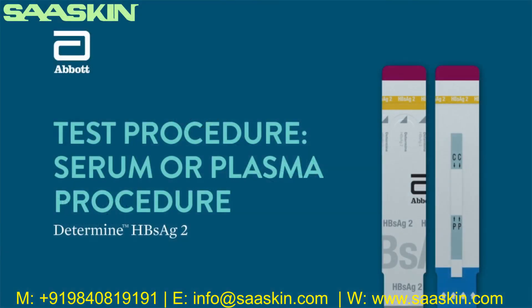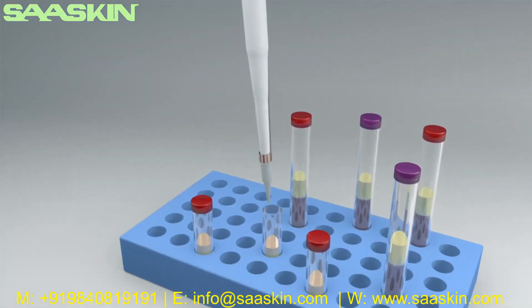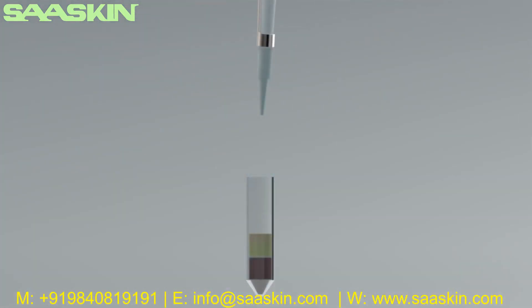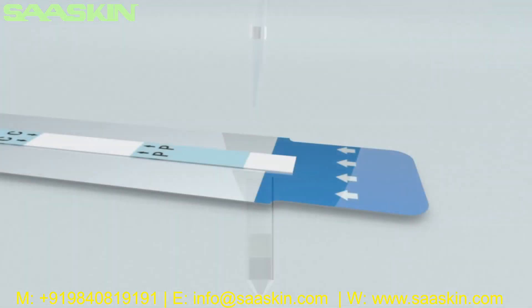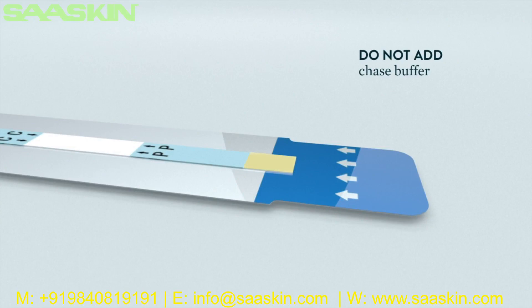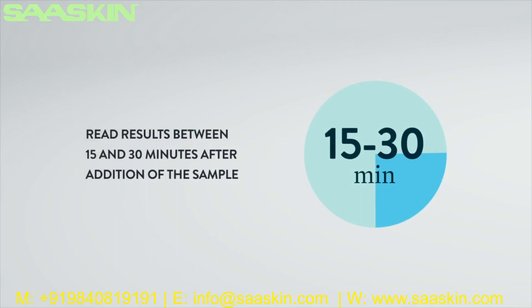Serum or plasma procedure: Carefully remove the 50 microliter test sample from the supernatant. If a lipid layer is formed on the surface of the liquid, ensure that the sample is taken from the clear liquid below that layer. Apply serum or plasma sample by touching the tip of the precision pipette to the sample pad. Do not add chase buffer when using serum or plasma specimens. Read the test result between 15 and 30 minutes after the addition of the sample. Do not read the test results after 30 minutes.